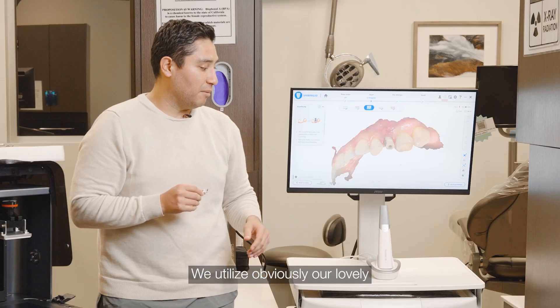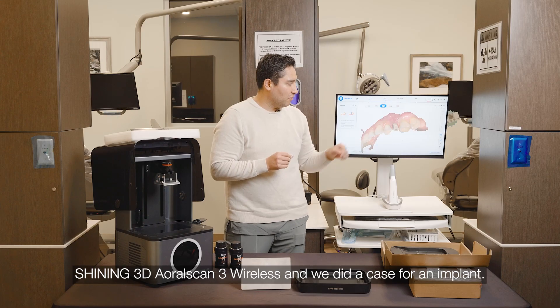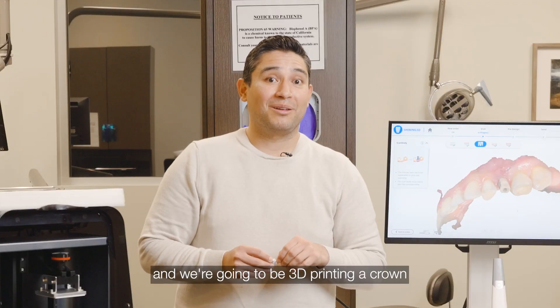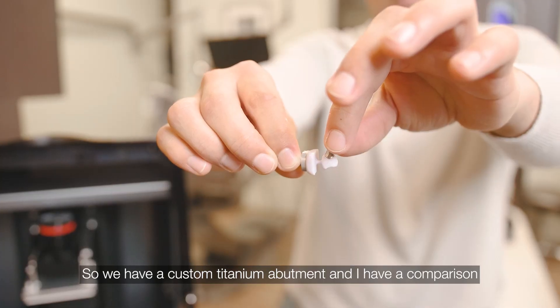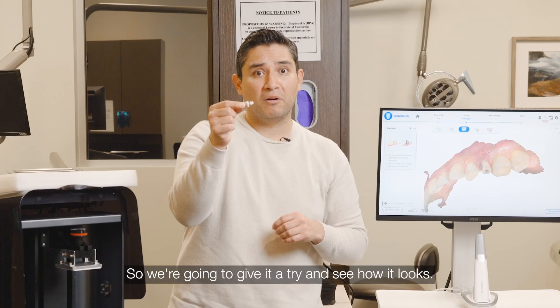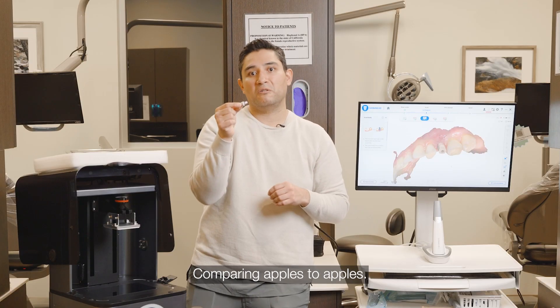We utilize our lovely shiny 3D AeroScan wireless, and we did a case for an implant. We scanned a scan body, and we're going to be 3D printing a crown with our lovely new technology here. So we have a custom titanium abutment, and I have a comparison, which is a mill block LTA2. We're going to give it a try and see how it looks — comparison apples to apples.